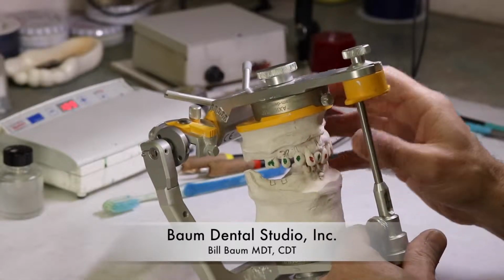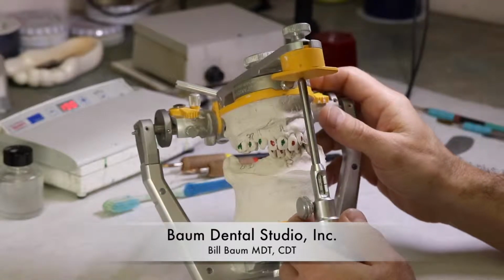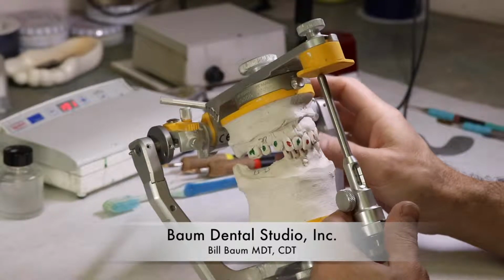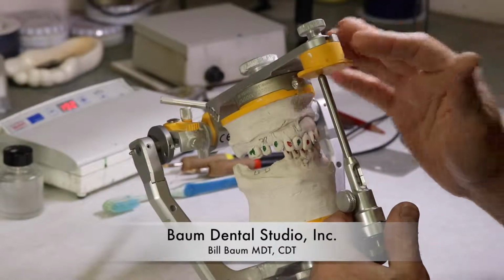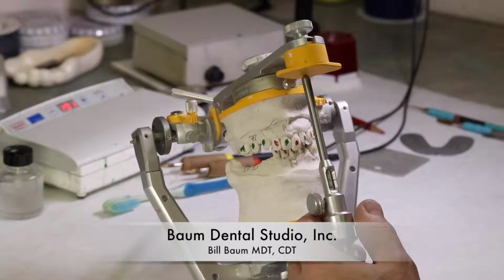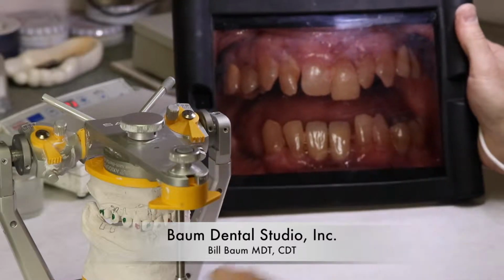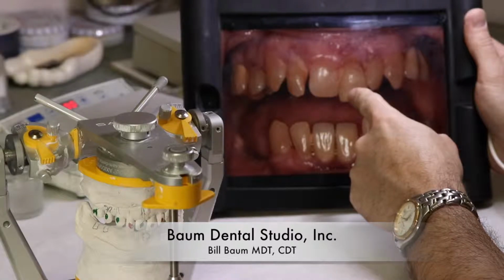So with this, I cross-mounted these casts with the cast I'm going to be working on for the diagnostic wax-up. And where I start from is, well, what's right about these teeth? I was provided a number of photos. I can show a few of them here, maybe two of them. And what we did determine is that the patient's midline is where we want it to be.